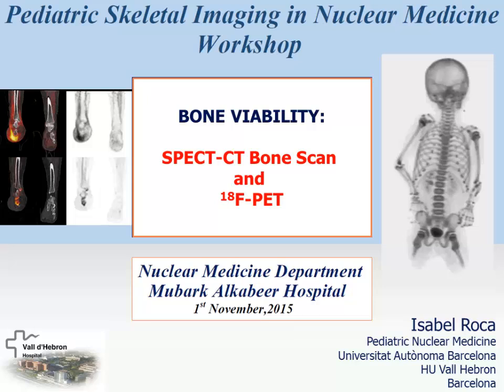Okay. This second talk is one of my favorite topics. We are going to speak about bone viability with SPECT bone scan and with PET with fluoride.